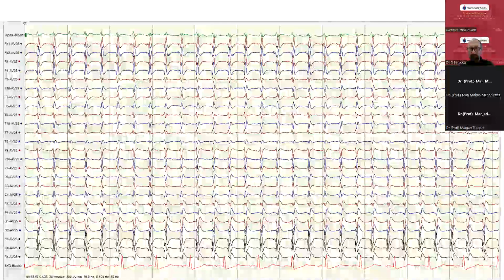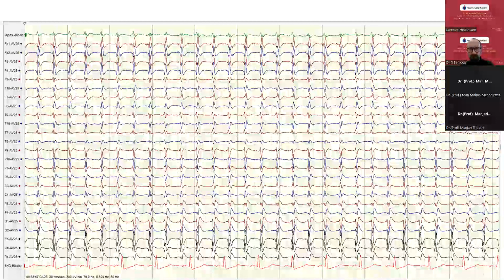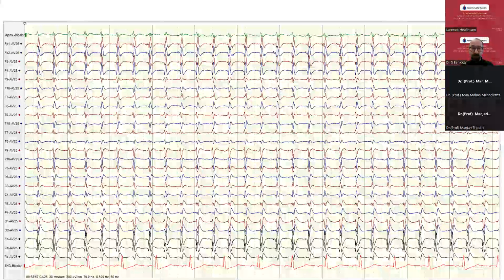Now, this is the corresponding pattern you can see in the intensive care unit. So you see these spiky generalized periodic discharges which are rhythmical, and their frequency is beyond 2.5 hertz. And this satisfies the first or primary criterion of the Salzburg criteria for non-convulsive status epilepticus. So again, epileptiform discharges with a frequency higher than 2.5 hertz.